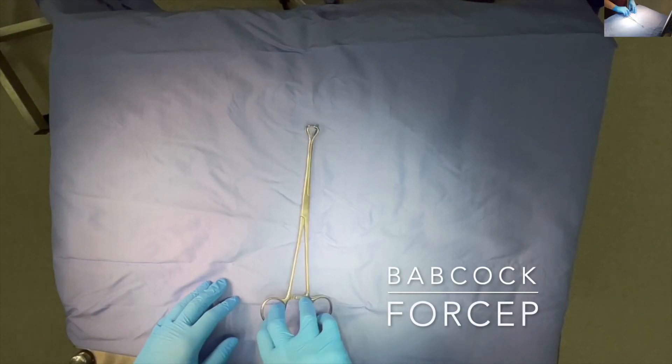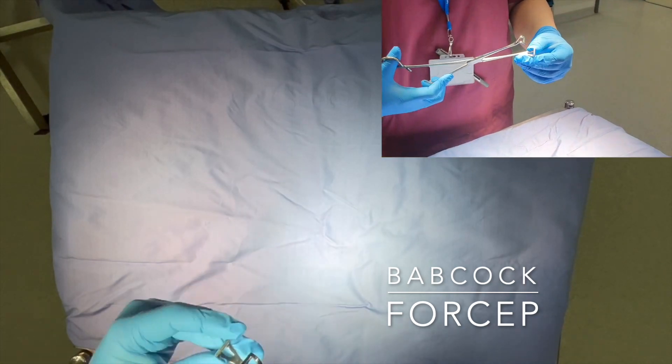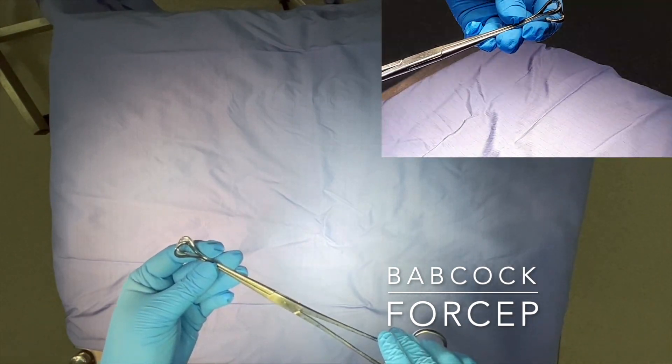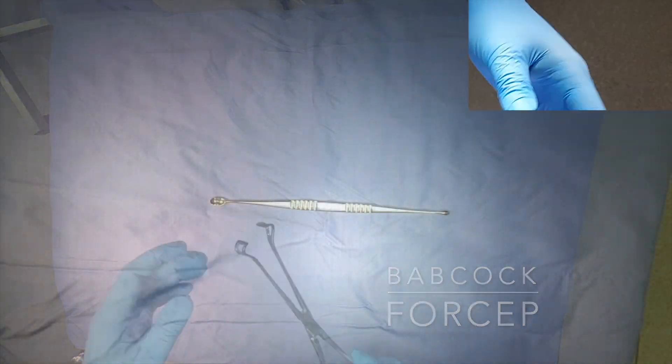The Babcock forceps is used to hold or grasp bowel and is non-traumatic, because it has broad flat edges to disperse the overall force across a wider area. It often doesn't have a ratchet to prevent any crushing of the tissue being held.